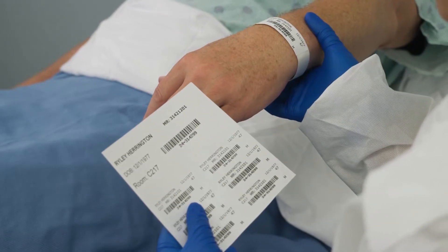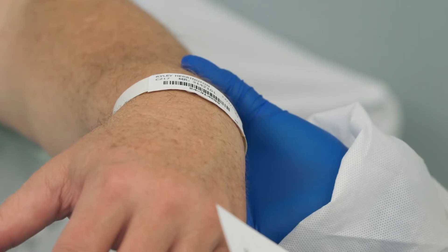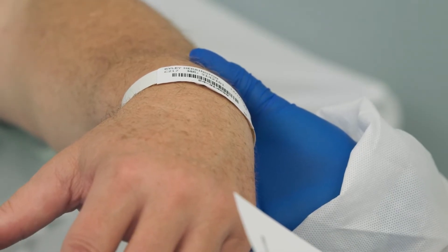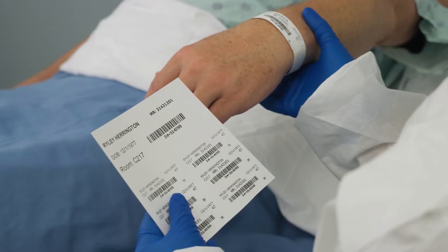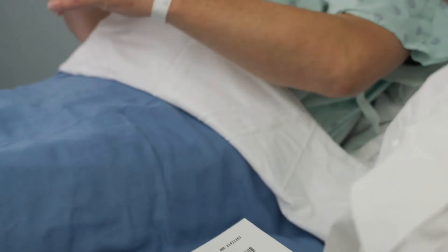Before starting the collection procedure, confirm the patient's identity. Check that the requested laboratory test and patient information matches the patient's identity. This could be either using a printed label, form, or mobile device.